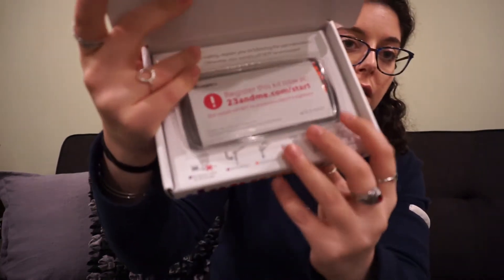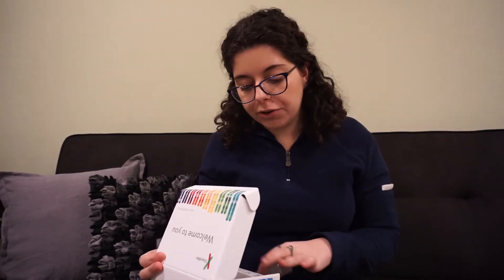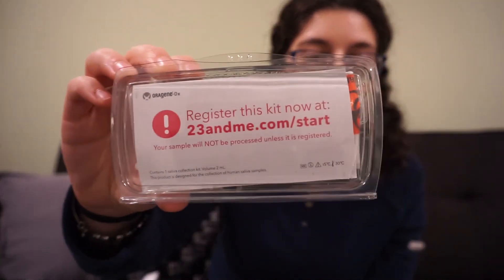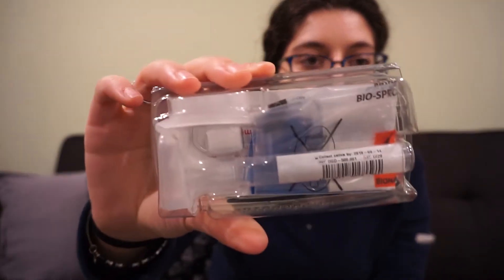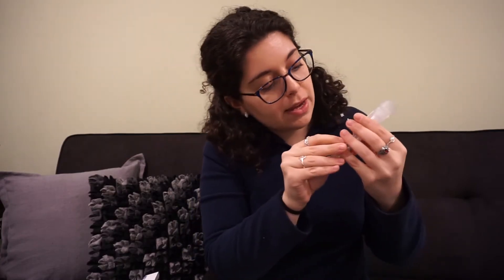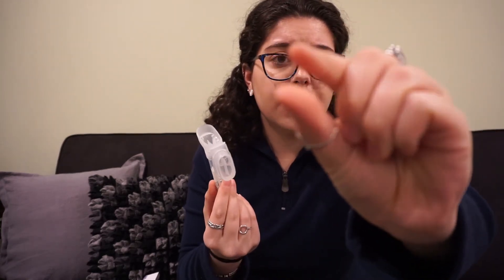So let's open it up. This is what is on the actual inside. There are a lot of rules you have to follow. The big one is that you can't have any food or drink for 30 minutes before doing the test itself. This is the kit itself, and this is what the back looks like. This is the tube itself — you spit right into here and it goes to this fill line. You only actually need about this much saliva.